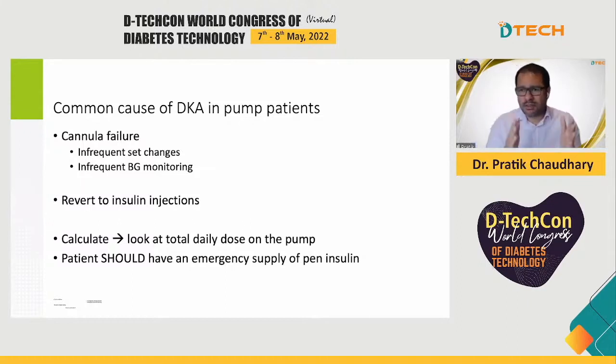So we know that cannula sets last for 3 days, but certainly in a self-pay market like India, I'm sure people try to stretch out the cannulas for 7 or 8 days as long as they can to reduce their costs. And every day past the third day that you keep the cannula in, your risk of ketoacidosis goes up. And that's why as people running pump services, of course, we get very anxious when we see people not monitoring.